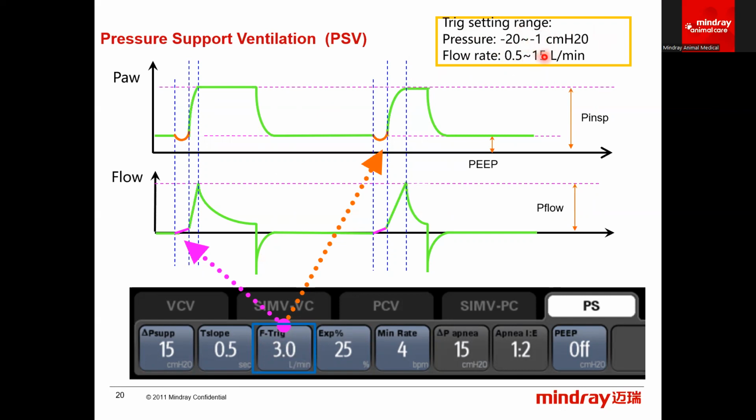or if you just want to make sure that you're only ventilating your patient when they're trying to take a nice big breath, you make it a little less sensitive and you dial down that airway pressure. You make sure that your patient is taking a nice deep breath before you give them that additional ventilation, because if this is too sensitive, you'll end up hyperventilating them, because we don't want every single puny breath to be supported. We only want a reasonable rate of breaths to be supported. So you can see there's our trigger right there for our airway pressure, and there's our trigger right here for our airflow.